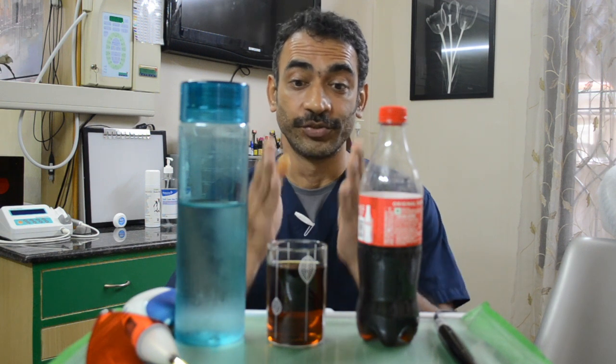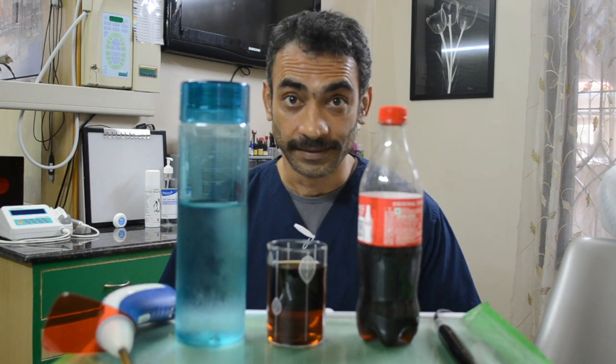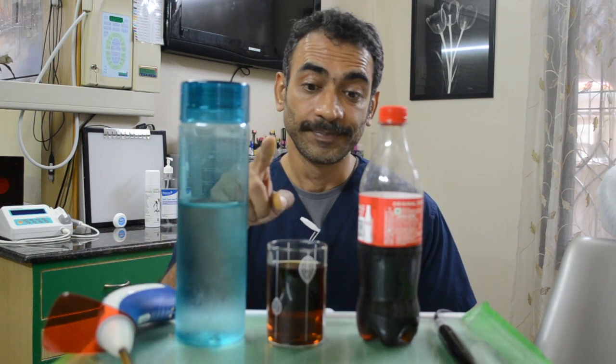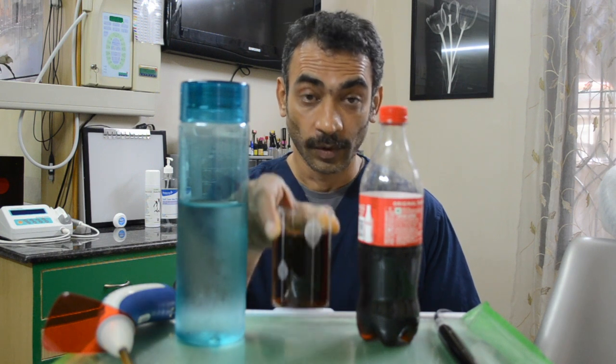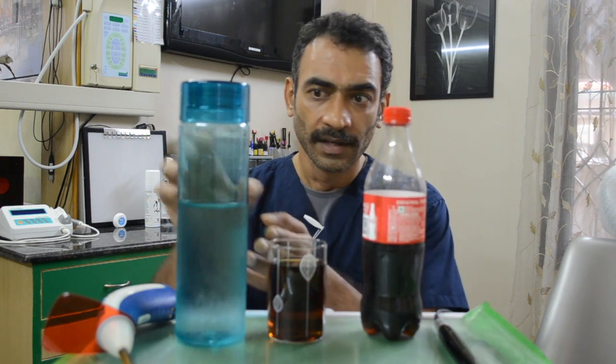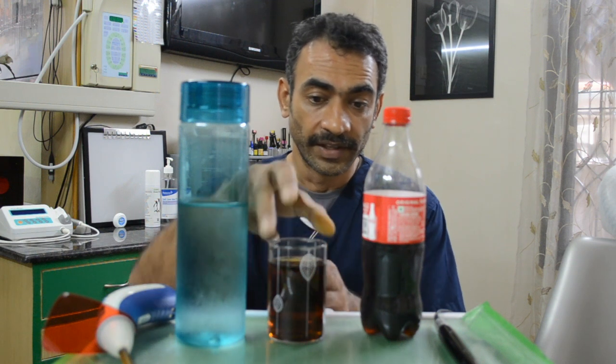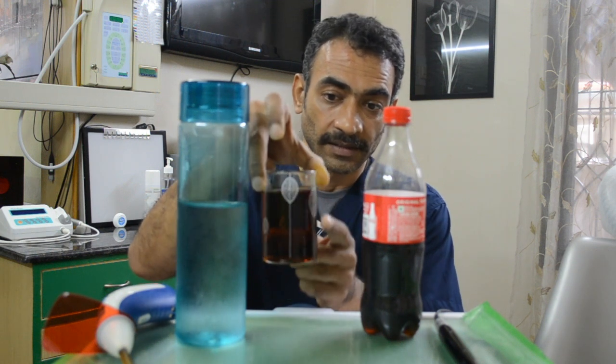Hi and welcome back to the Dental Advisor. Today we're going to do a simple test to check out whether your curing light does its job or not. To do that, get yourself a glass — an ordinary glass — fill about a third with Coke or Pepsi just for the color, and then fill the rest up with ordinary water, and you get a color something like this.